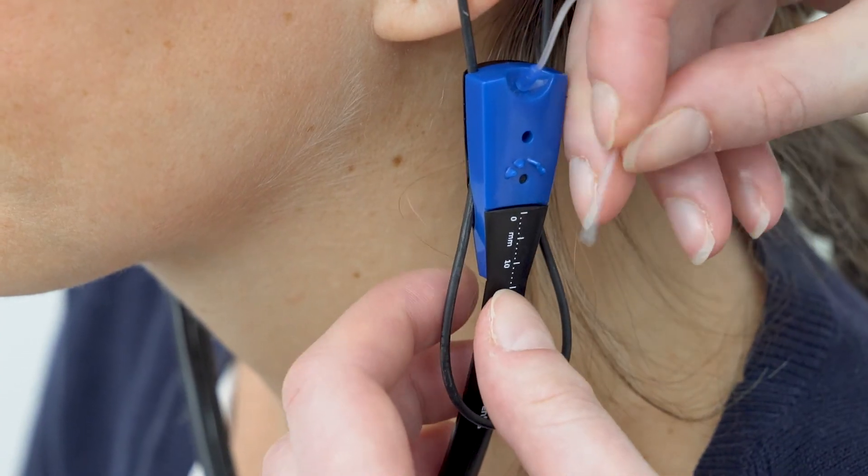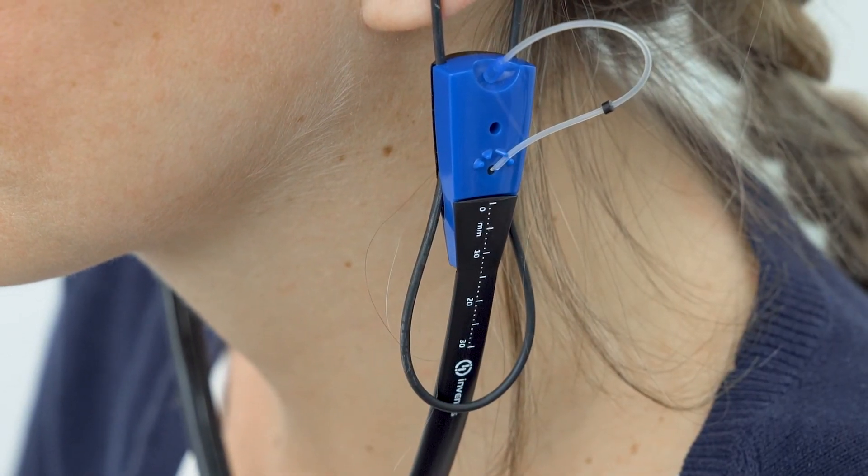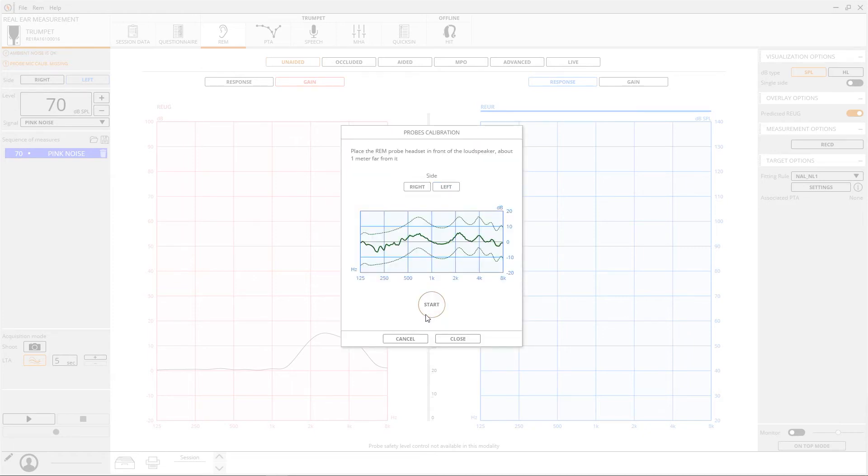After, probe tubes must be calibrated. Each tube has to be placed close to the reference microphone and then calibration should be started. Once this phase has ended, we will be ready to acquire the first measurements.